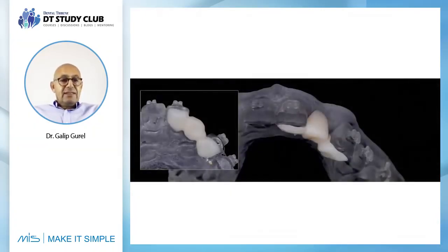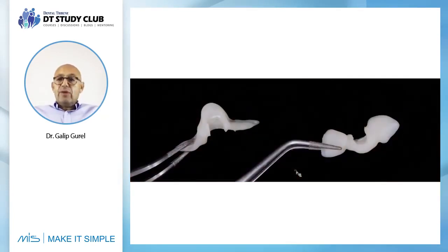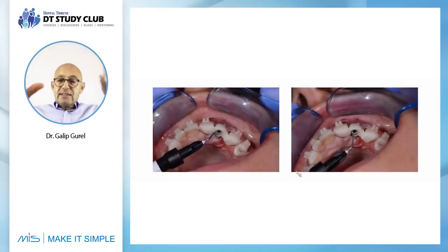And meanwhile, as Junaid was doing this, we were doing the Maryland provisional. But if you take a look at this, there's a huge gap between the lateral and the canine. Well, the reason is that we wanted to build up the exact final shape or space of this lateral and then capture it. Again, we open the palatal side, we place it over the provisional abutment.